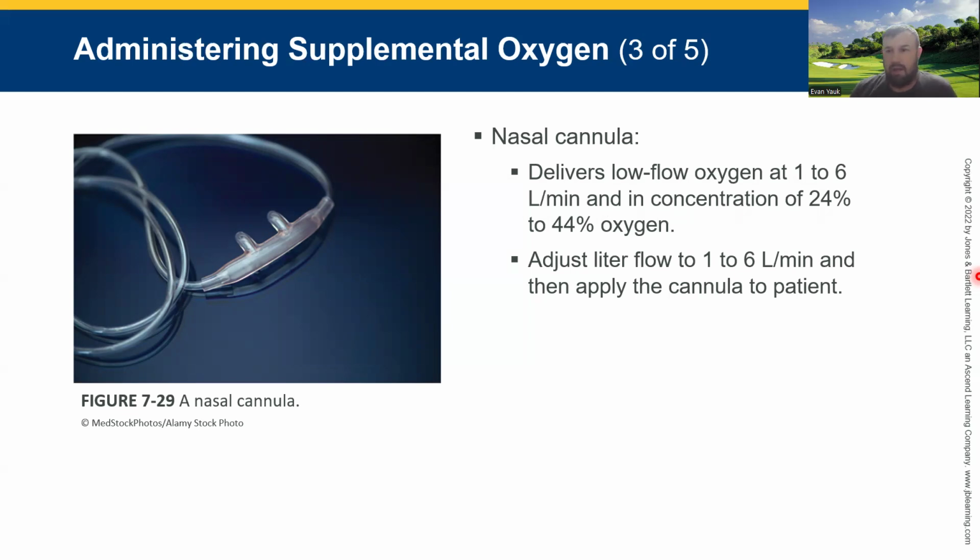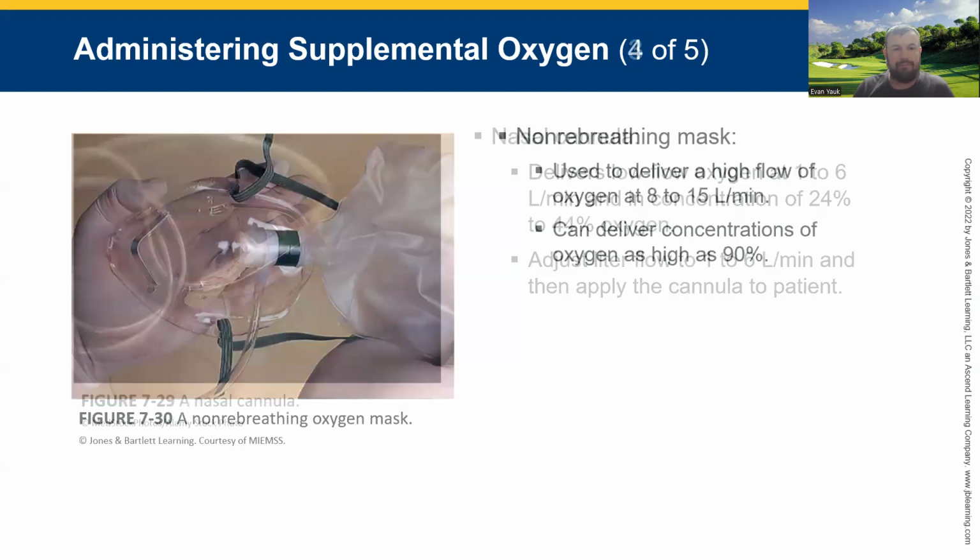I use a nasal cannula a lot of times if my patient is shooting around 93, 92. It talks about this here in a second, but what we want is 94 or above. So I'll just give them 2, 4 maybe at the most, and I just bump them up there. I watch on my pulse ox, and we want to keep them above 94.